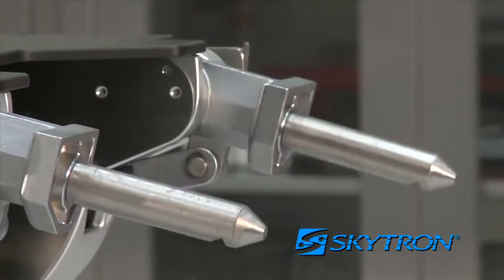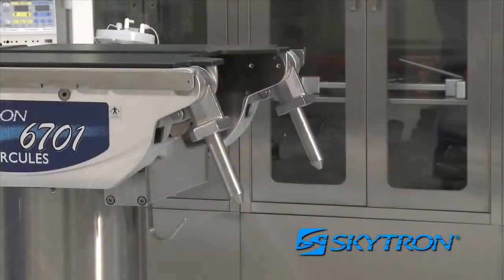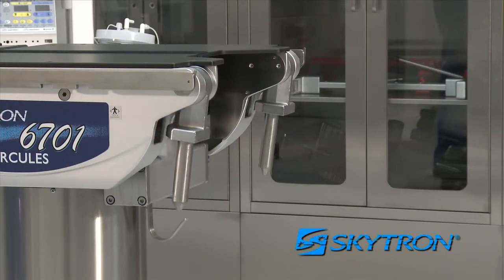For safety, once the leg section is removed, press and hold the leg down button on the pendant control until both leg pins come to a complete stop in their full downward position.